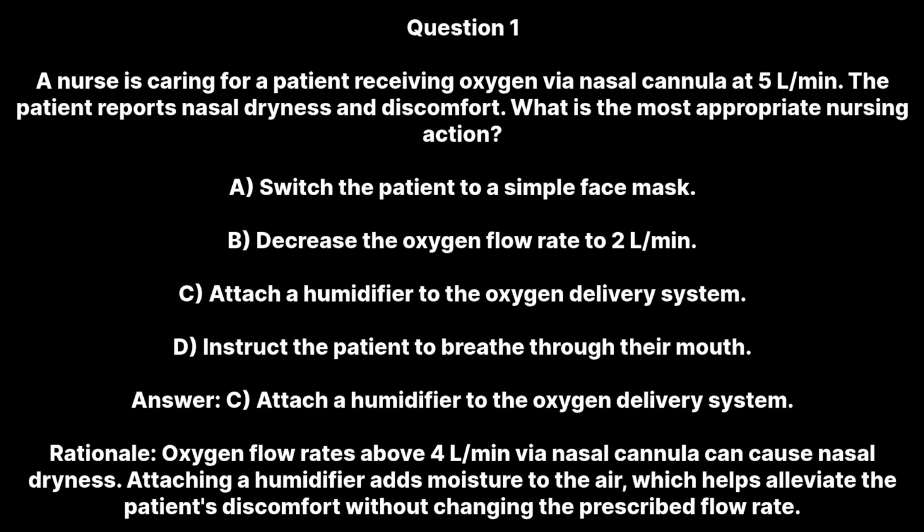Rationale. Oxygen flow rates above 4 liters per minute via nasal cannula can cause nasal dryness. Attaching a humidifier adds moisture to the air, which helps alleviate the patient's discomfort without changing the prescribed flow rate.